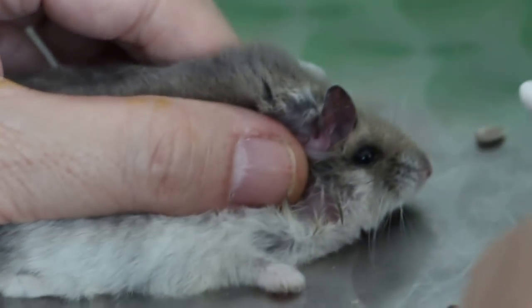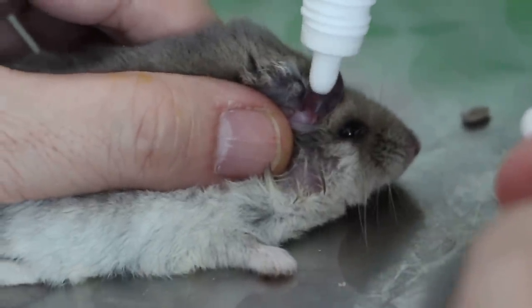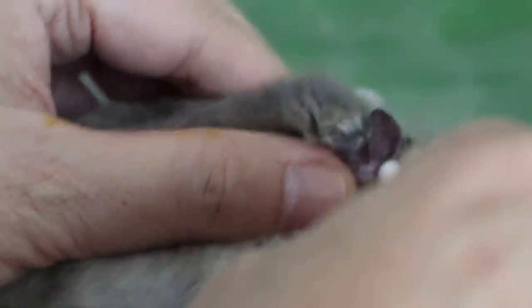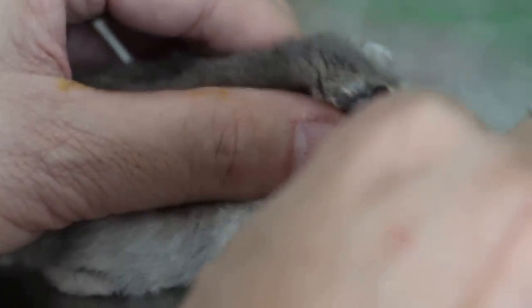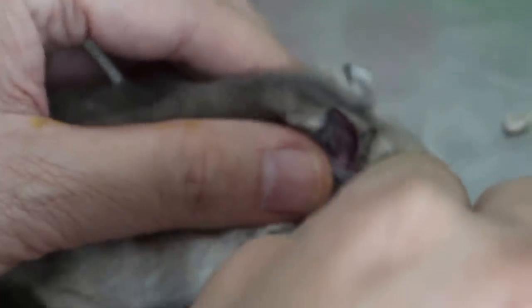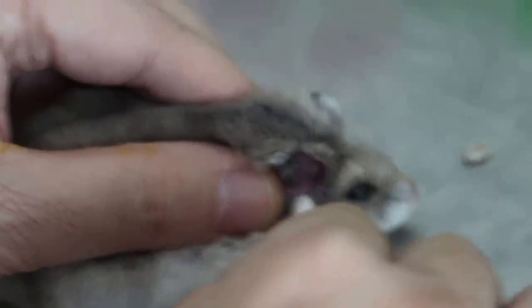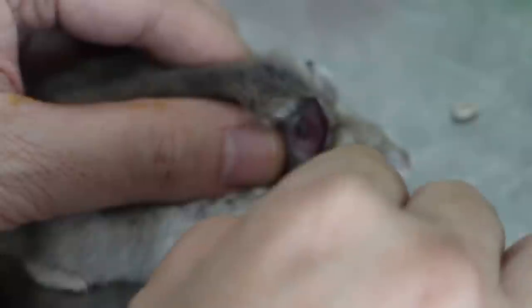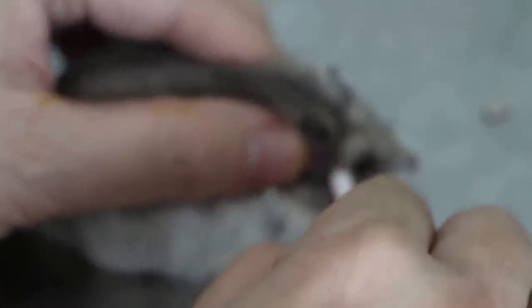Rather than use fingers because it might get bitten, you see. One drop, ok. Then I think we just use the extension of the finger by using a cotton bud. And this cotton bud goes in and massage. This is the canal, this is the vertical canal.